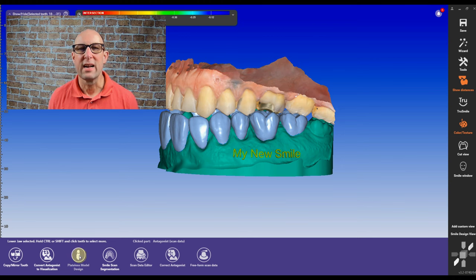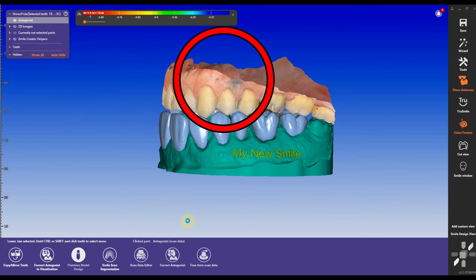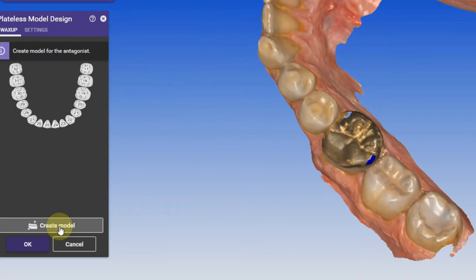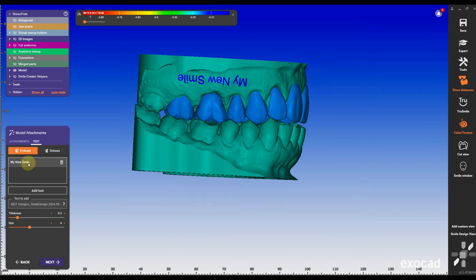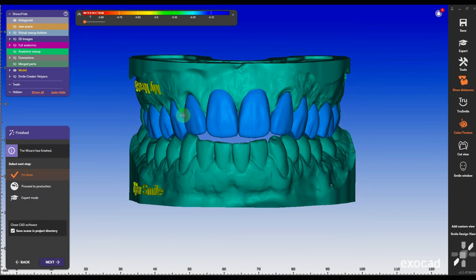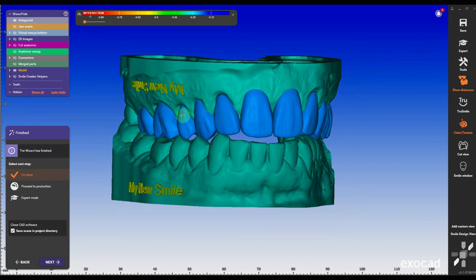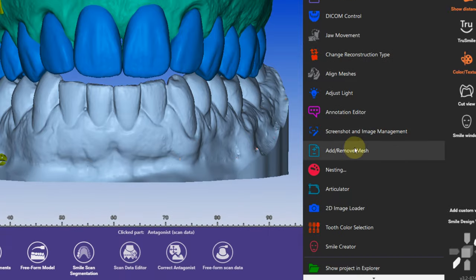If you want to include the antagonist and make an extra model for it, just click on it and create the model — it's very simple. You can add the same text on the antagonist: 'my new smile.' I don't put any attachments on this one. You can put the iTero attachments on there, so you have a nice iTero one.